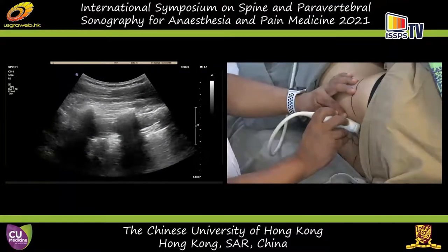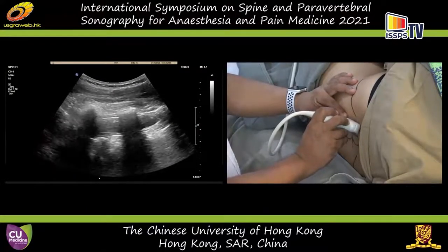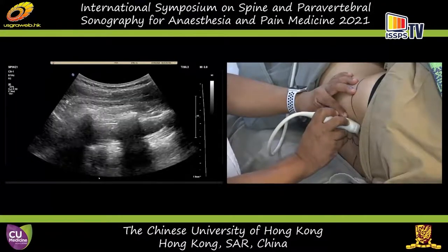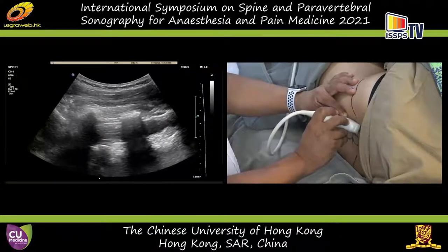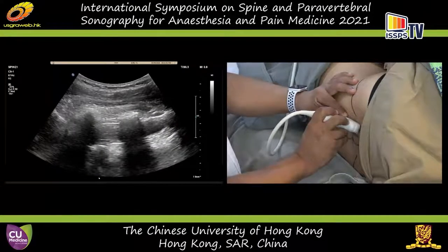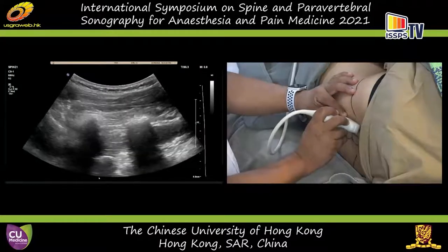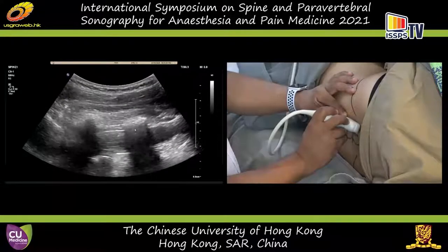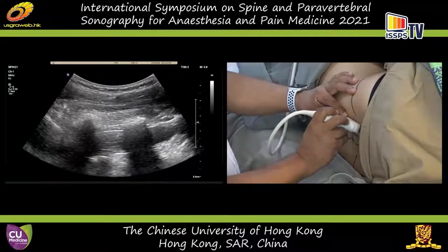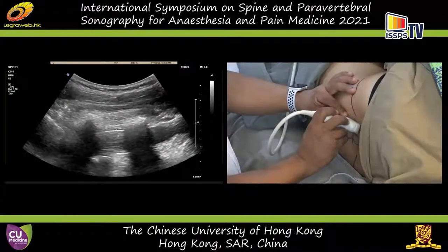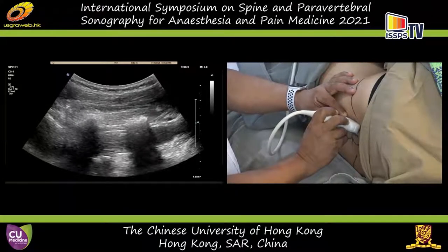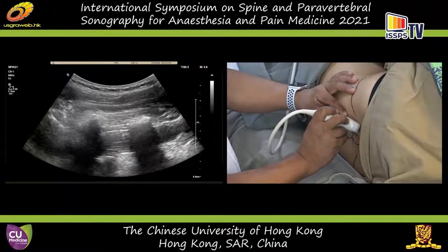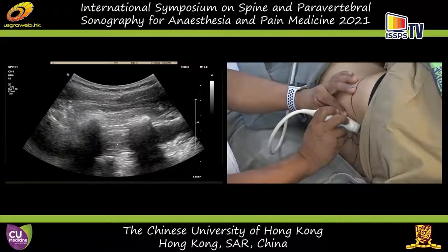I'm going to now optimize this view — just move the focus up a touch, and reduce the depth so we can get a bit more magnification. You can see the lamina of L4 and L5 very clearly. You can even see the epidural space outlines here — the narrow epidural space with the intervening fat-filled space. The posterior dura is behind.